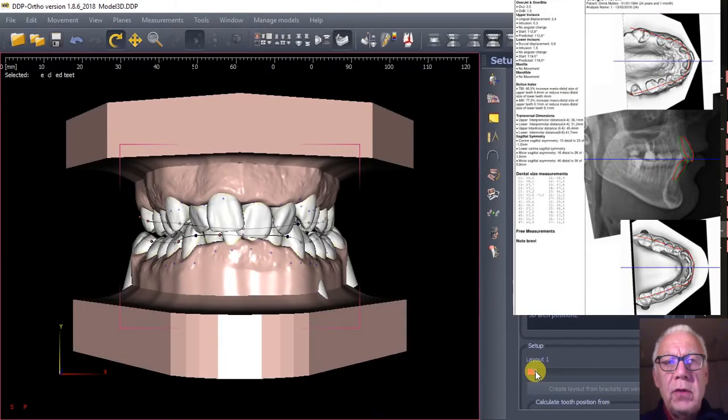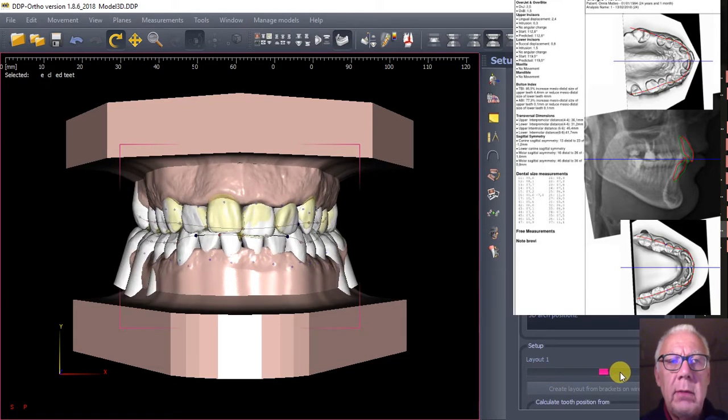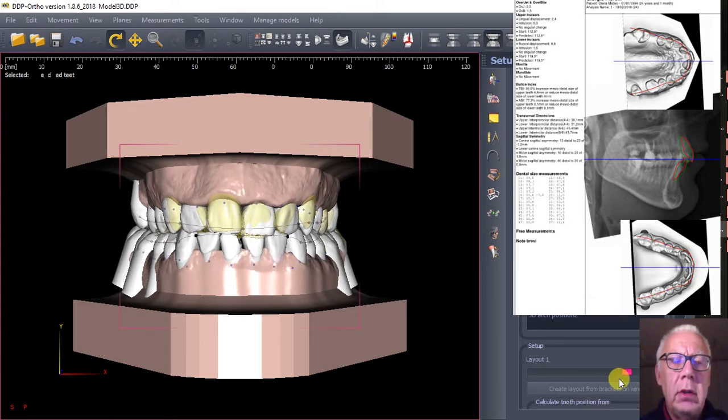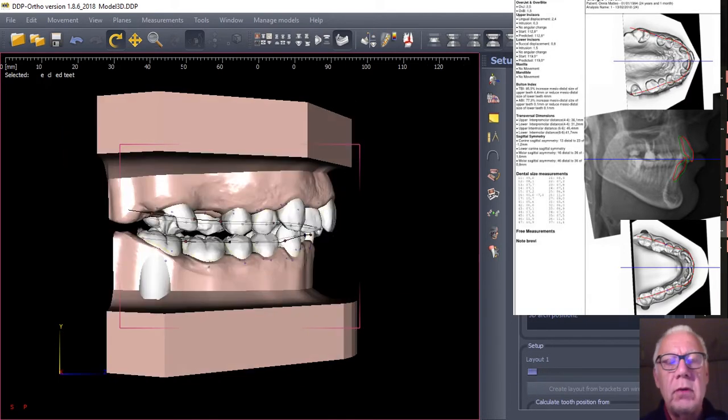Hello, this is Dr. Giorgio Fiorelli and I would like to show to you some images from the digital setup that we are able to produce using the T3DO occlusogram software together with the DDP digital modules from Ortolab.